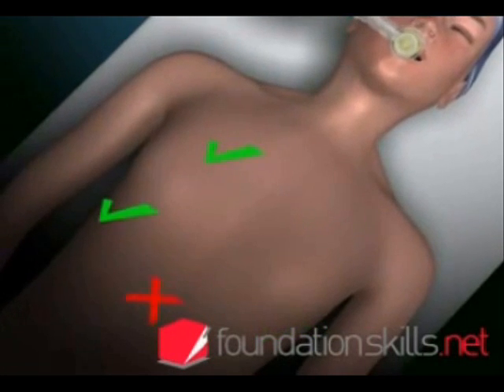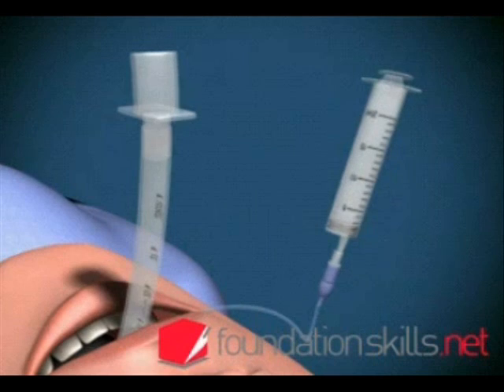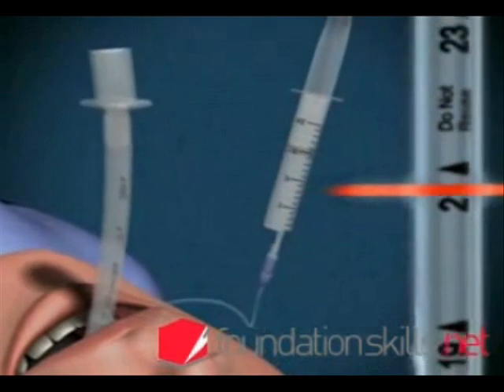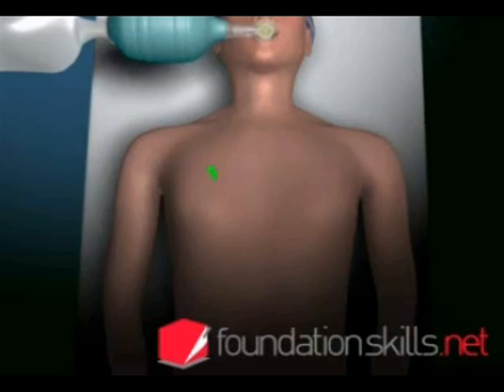If the tube is in too far, the right lung will be ventilated only via the right main bronchus. If this occurs, deflate the cuff and withdraw the tube 2 to 3 cm. Re-inflate the cuff and re-check the position.